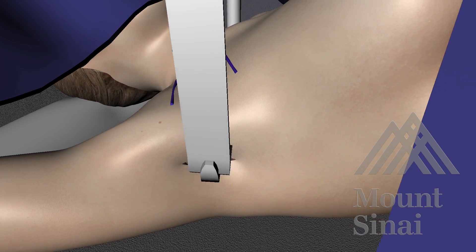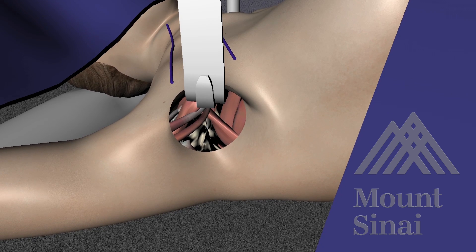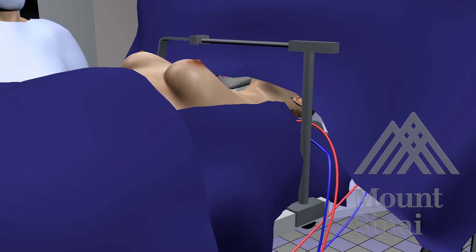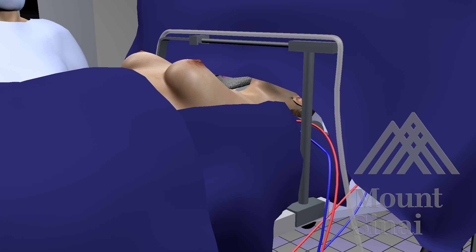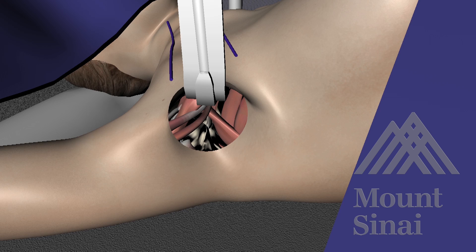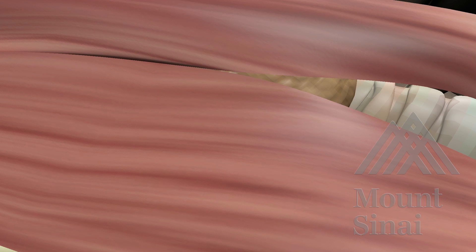Insert an external thyroid retractor and secure it in place in order to preserve visualization. This procedure uses laparoscopic instruments but is a completely gasless system. However, suction tubing is connected to remove smoke from the use of ultrasonic and bovie devices. With the retractor in place, you can extend the cutaneous pocket until you reach the sternocleidomastoid muscle.